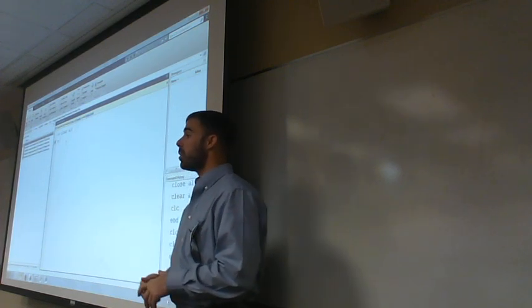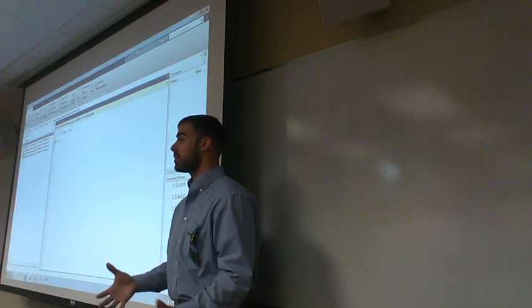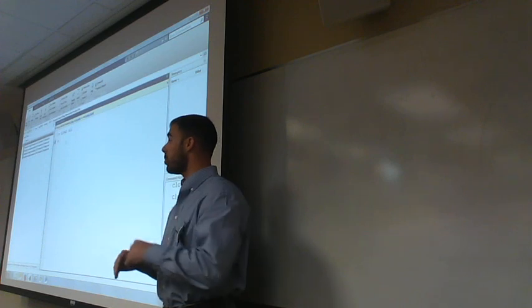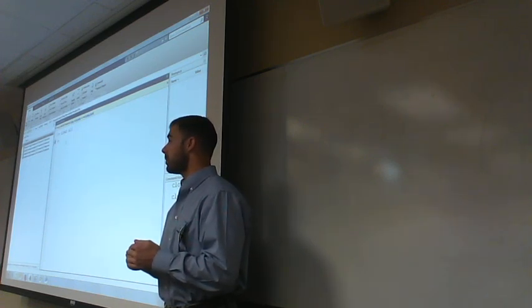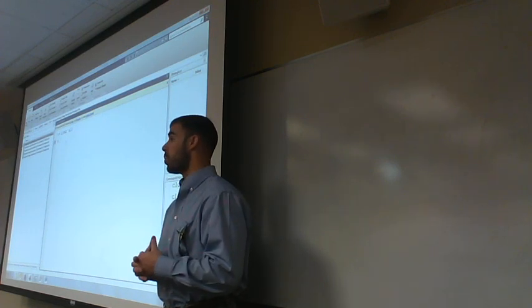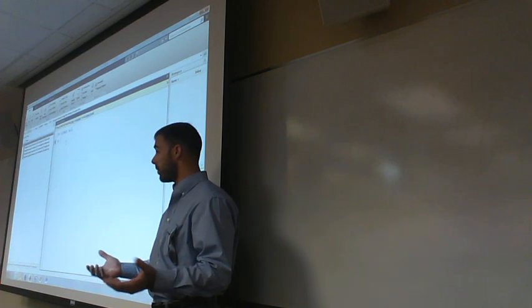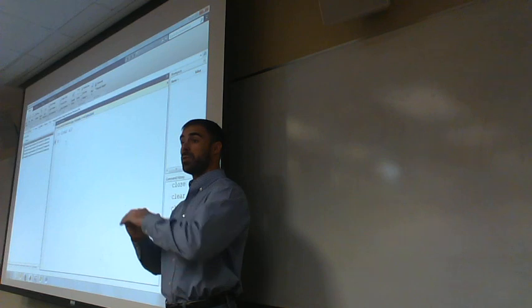In general, what we're going to do is take our normal microvolt ERP effects. Now remember, an effect is a subtraction between two conditions. So let's say old minus new is going to give us the memory effect. And anywhere there's a difference in that subtraction between the two ERP conditions is essentially considered a difference due to memory, right? This is basically Donders' subtraction logic, canonically in the field. And so we have an ERP effect that we can plot as a difference wave and see the topography of.